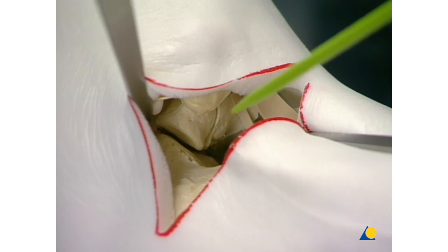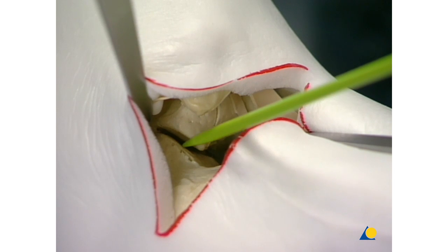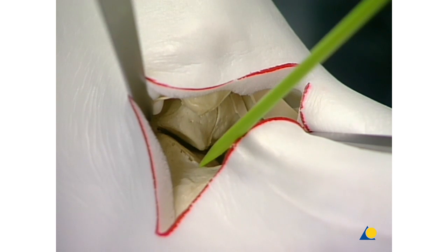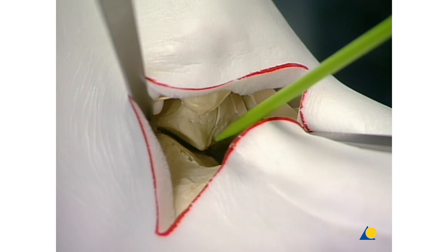Here we see the posterior facet of the calcaneus and talus and approximately pediculated large fragment of the lateral process of the talus.